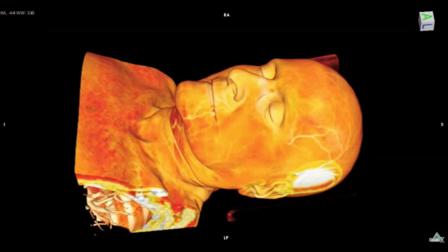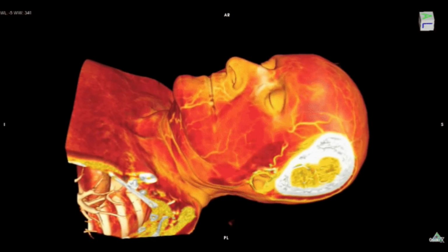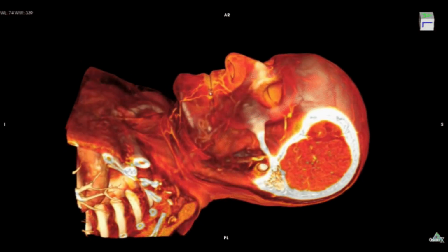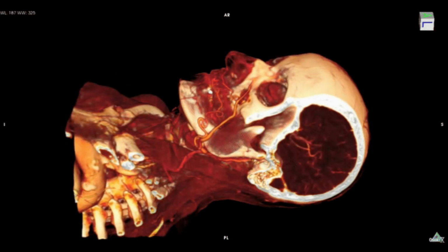In some cases, a contrast agent is used to increase the contrast of structures or fluids within the body. Contrast agents are commonly used to improve the visibility of blood vessels and the gastrointestinal tract, enhancing the quality of an MRI scan. All this said and done, it is important to remember that CT scans use X-rays, which involve a small amount of ionizing radiation. Doctors use CT scans when they believe the benefits outweigh the risks, and they take precautions to keep the radiation exposure as low as possible.